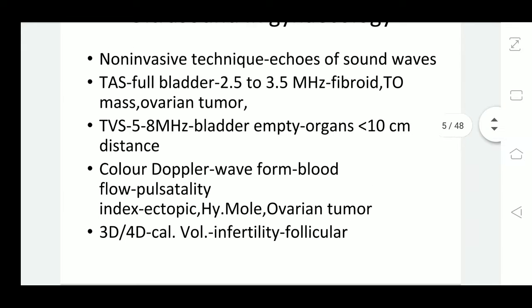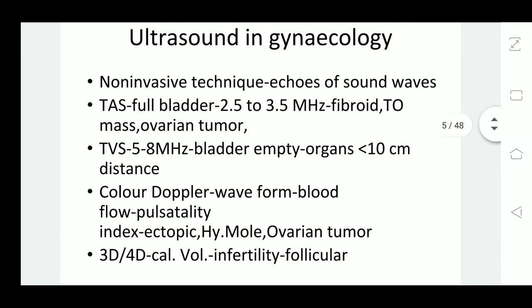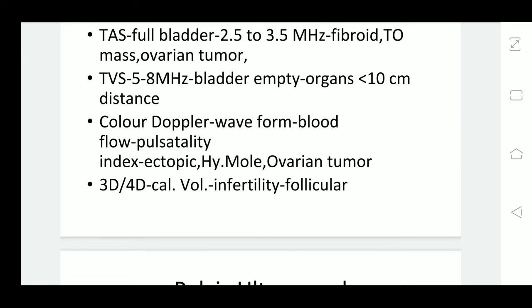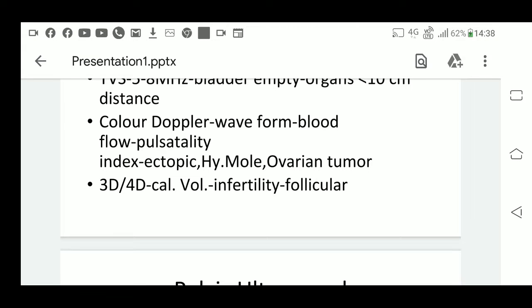Color Doppler is very useful whenever we are assessing ectopic pregnancy — we want to know the vascularization, and it sometimes helps us decide whether to do medical or surgical management for ectopic. Another case is hydatiform mole. After evacuation of a hydatiform mole, when the patient comes for follow-up with continuous bleeding, we assess whether there is still viable molar tissue. If vascularity is present in the residual tissue, it is viable molar tissue requiring cytotoxic drugs. If not, there is no viable molar tissue.